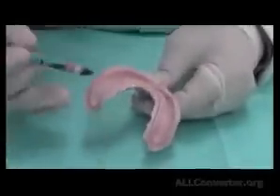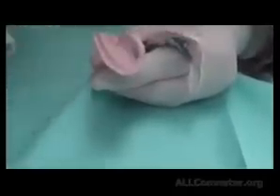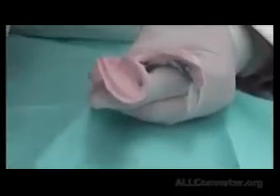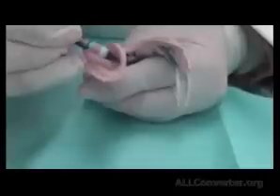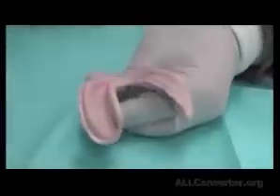If I have an area where we call a pressure spot, like this, the only area here recorded, I could mark it with indelible pencil. This pencil will copy itself into the cast once it's poured, and I just make sure that the denture here should not press on this, and I record this area.